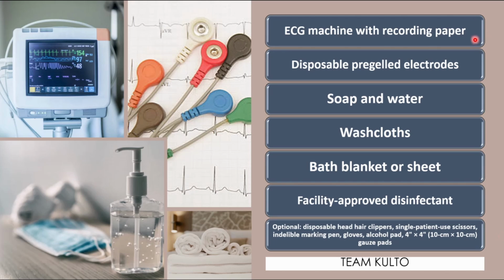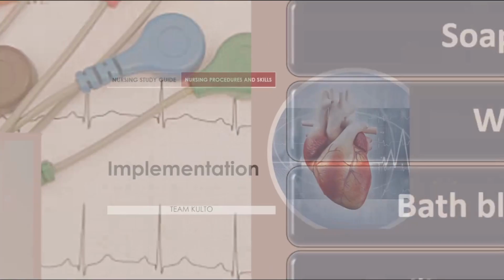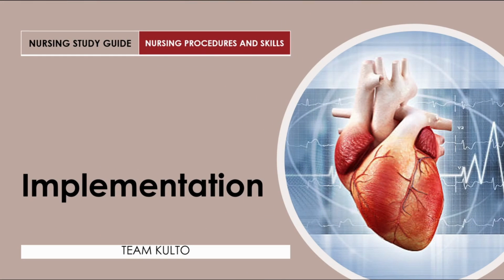Okay? Anong basa dito, guys? Pre-gelled. Okay, pre-gelled ha, hindi pre-gelled, pre-gelled electrodes. Alright, so yun ang mga equipments mo. Ito naman yung implementation na tayo, nurses. Medyo mahaba ito. Ready ka na?